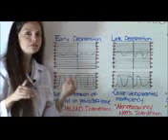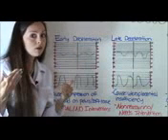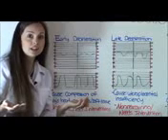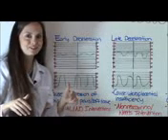And we want to make sure, of course, it doesn't dip below the normal, anything less than 120. So you're just going to see right whenever that mom has a contraction, the baby is going to mirror the mom, and heart rate is just going to dip a little bit right whenever that contraction happens. So it's completely normal. It's the only normal one out of the three.